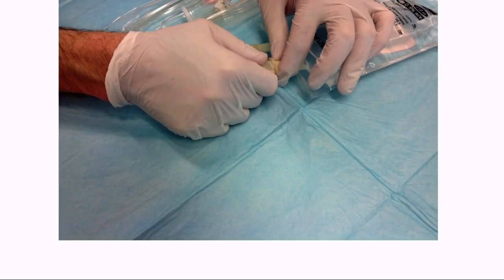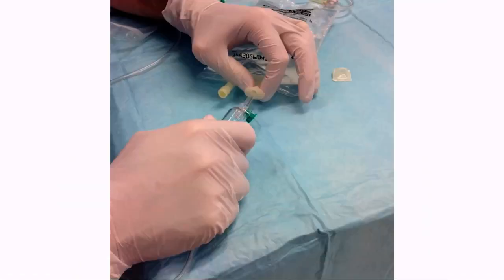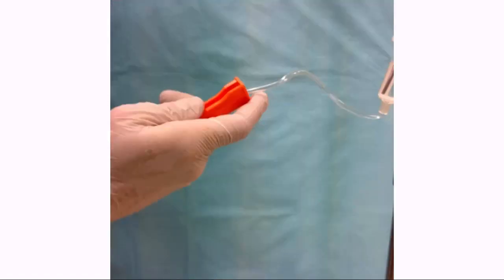Then we're going to take off the cover of the infusion bag, and we're going to put the spike into the infusion bag. The roller clamp is still closed at this stage, and what we do is we squeeze the drip chamber to allow some solution to come from the bag into the drip chamber until it's about 1/3 to half full, as you can see, up to this level here. Then we're going to gradually open the roller clamp and see the solution start to come into the giving set. Do this slowly because we don't want any air to enter into the giving set line.